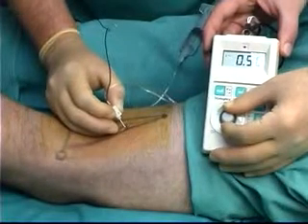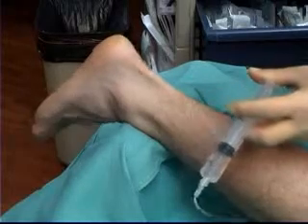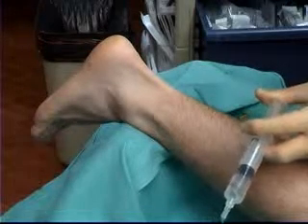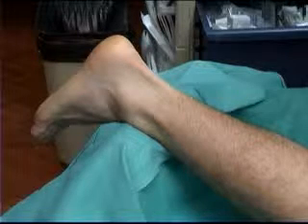Eversion of the foot occurs when the common peroneal fibers of the sciatic nerve are stimulated. Local anesthetic agent or any other electrically conducting fluid, such as normal saline, as in this demonstration, can be injected and the muscle twitches will stop immediately. This gives final assurance that the block will be successful.